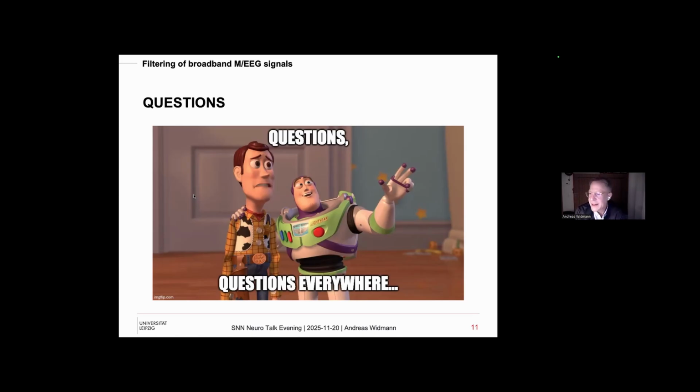If data are ugly, then they are ugly. These are data. We do not want to hide that EEG and MEG data are noisy. That's the nature of the signal. For example, in ERPs and ERFs, we use time window means. That is a low pass filter already, and for the statistics, the additional low pass filter makes absolutely zero effect. Just using that for the plots so that they look nicer is not necessary. For the high pass part, that can have absolutely massive effects indeed. For the low pass, I'm typically not so concerned if it's not too low. We will have one example in the second part where it was really too low.